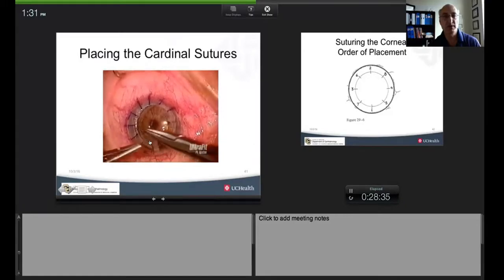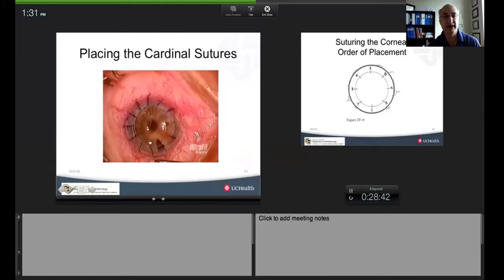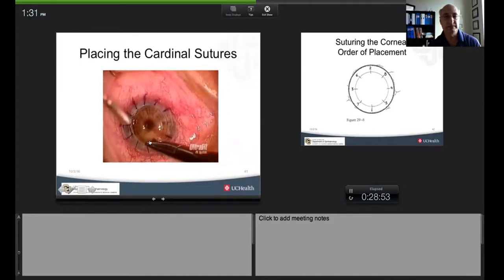I use a 2-1-1 pattern. I'll illustrate that primarily because I can control the tension on it and it's easy to bury. The idea with these knots is they're going to have to come out sometimes. So if you make a really big knot, sometimes they're hard to get into the eye to bury them, but they're very hard to get out as well. And then we'll trim it, leaving a little bit of a tail.